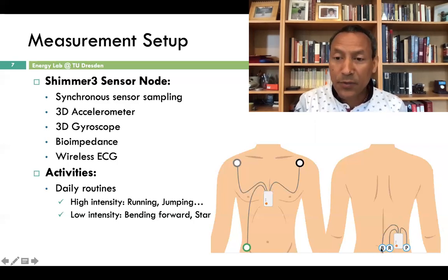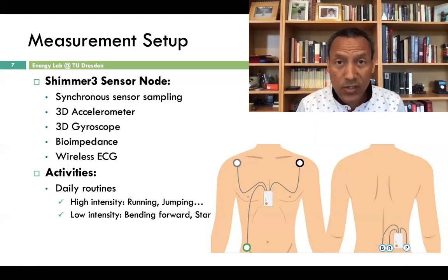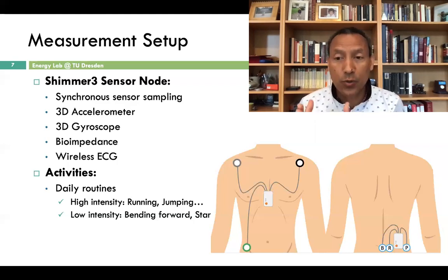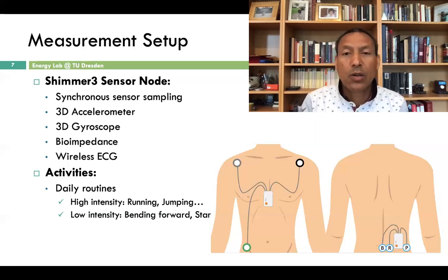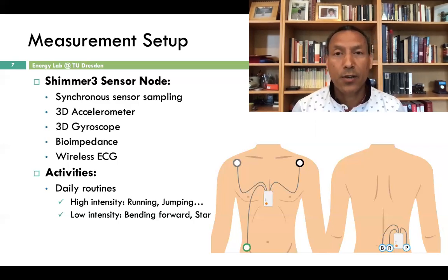So once we have the motion at this point, we can even mix it with a clean ECG signal so that we can test our approach using this technique. And then once it works, we can use the second approach for everyday use.